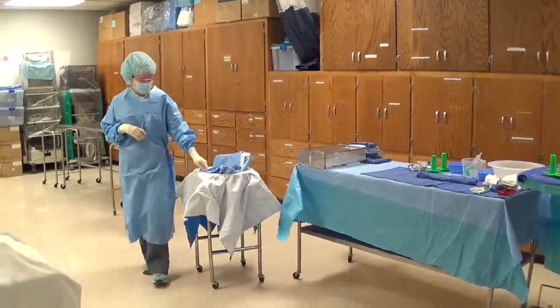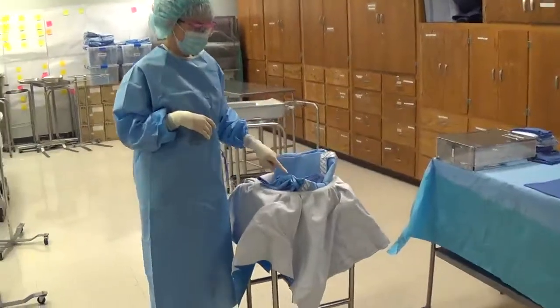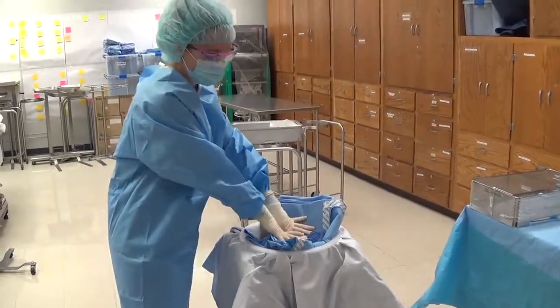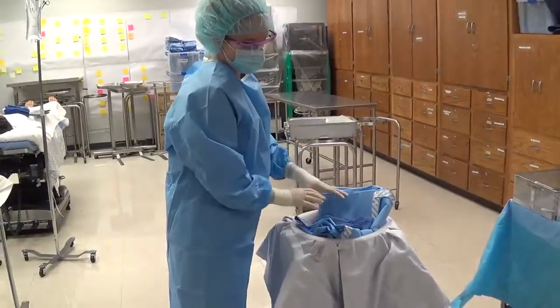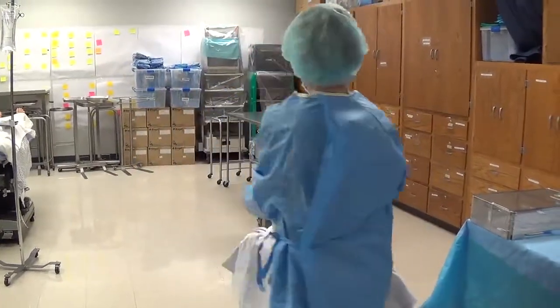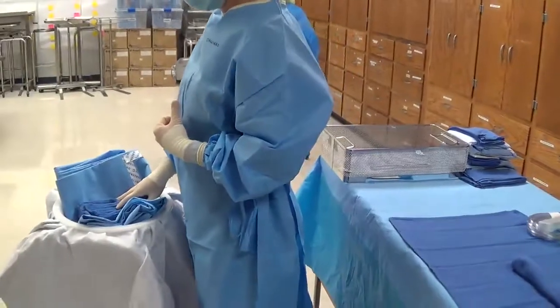When you move the basin there are a couple of things to remember. The basin is only sterile on the top surface, so you should be grabbing the basin with your hands on the inside. We should never see the thumbs or fingers around the side, and you also don't want to end up with your back to your back table when you're bringing up the basin.